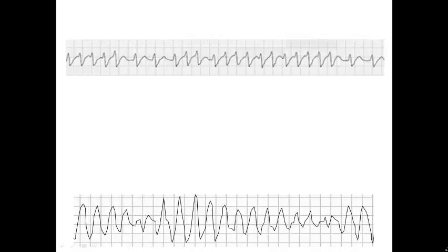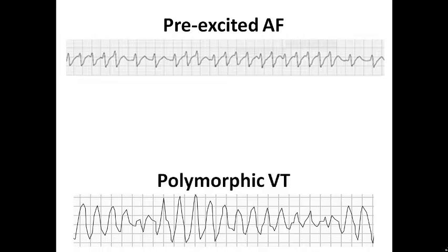So if we have this example: the top ECG is pre-excited AF — the complex morphology may be variable but shows only two or three morphologies, the axis is nearly the same, there are some very short RR intervals, and it is extremely irregular. In the other example, there is continuous change in axis, so it is polymorphic VT, most probably on top of a long QT interval presenting as torsade de pointes, as change in axis is not a feature of pre-excited AF.